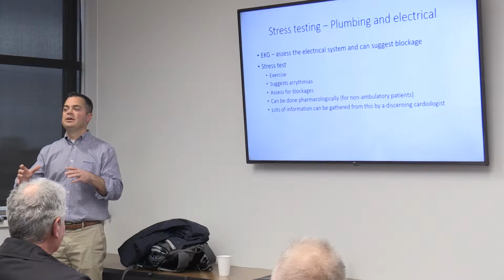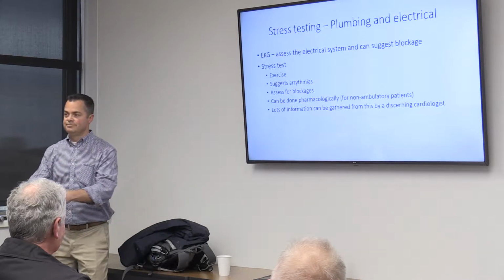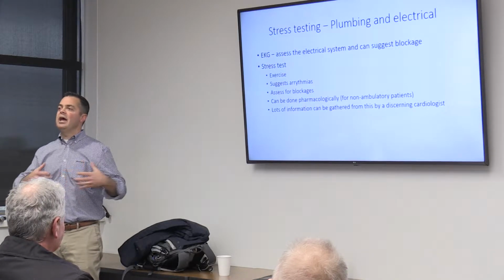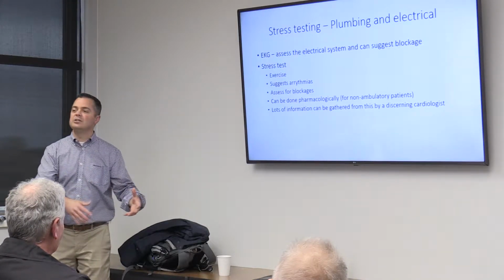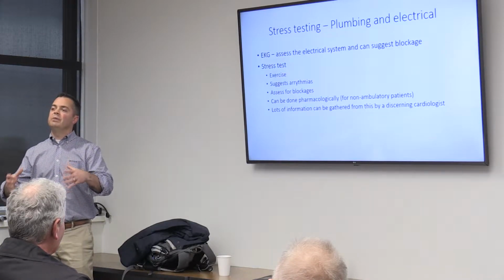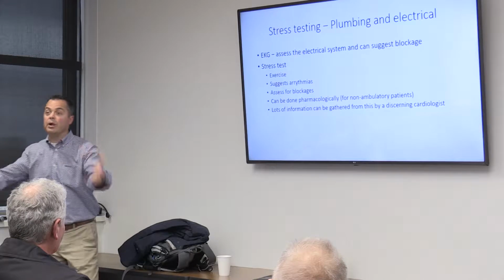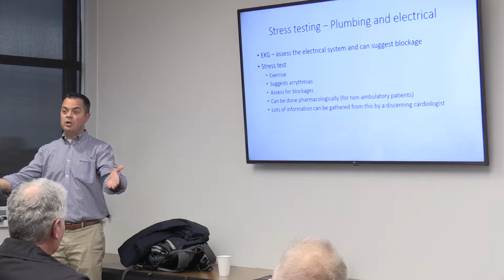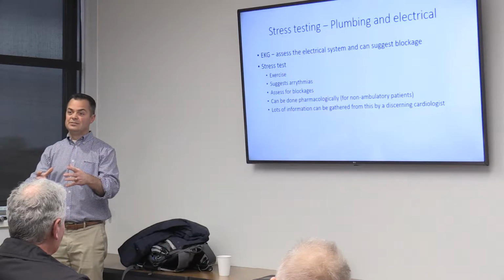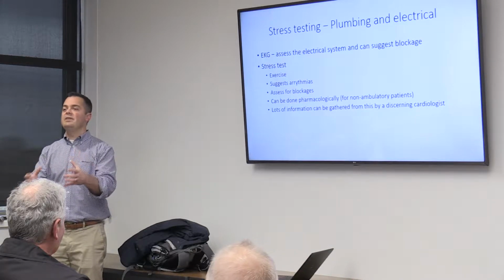Now, for some patients, we need to marry the exercise portion with imaging. Some of you have heard of an exercise nuclear stress test or an exercise cardiolite stress test. That's just an additional way of getting information from the stress test, where we take pictures of your heart before and after exercise and compare them. You can imagine what your heart's supposed to do when you exercise. Your heart's supposed to beat more vigorously. It's supposed to get stronger. You're demanding more of it. So we should be able to see that on the images.